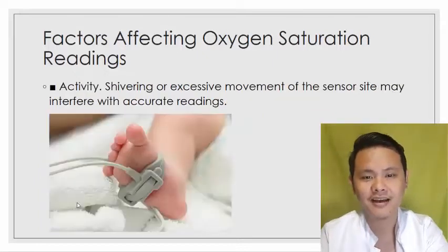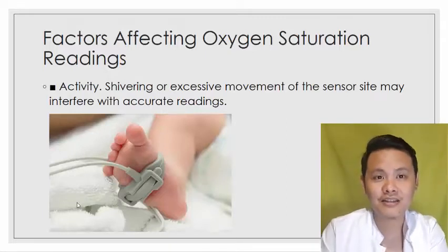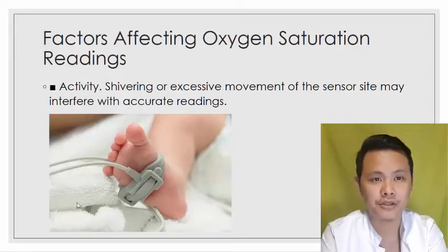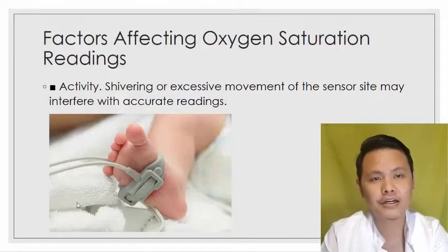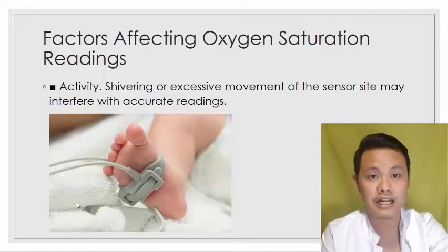Walang impairment. Okay, next, activity such as shivering o kaya naman activities lalo sa mga pedya. Kapag ganyan ang mga pasyente natin, be careful. Kasi minsan natatanggal, then ikakabit natin, minsan magiging output na niyan is irregular na. Irregular na po yung magiging reading. So we need to be sure na intact yung pulse oximeter natin.